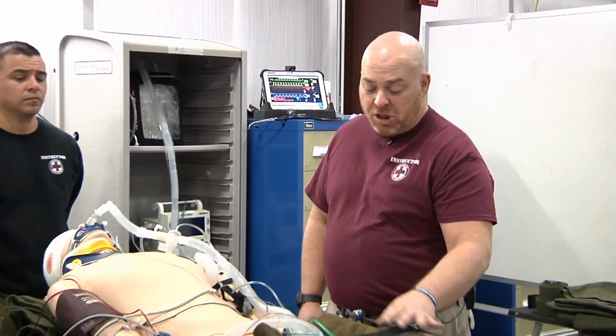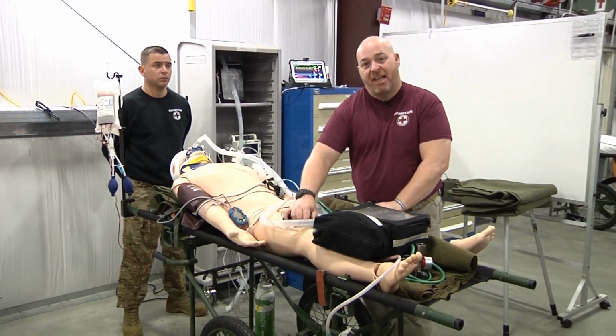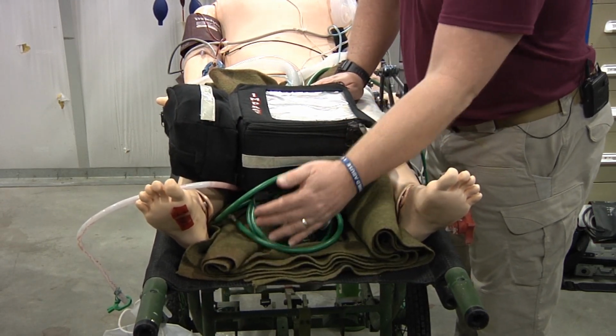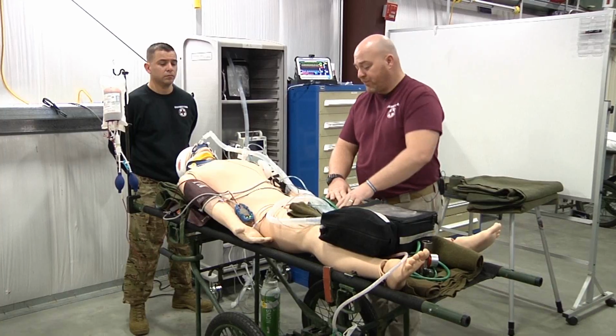Now that we have completed setting our patient up on the ventilator, I want you to note that we have taken some padding right here, placed it between the patient's legs, placed our oxygen bottle down here, pre-staged with our oxygen hose connected, ready for placement on our ventilator, and our patient is venting well.